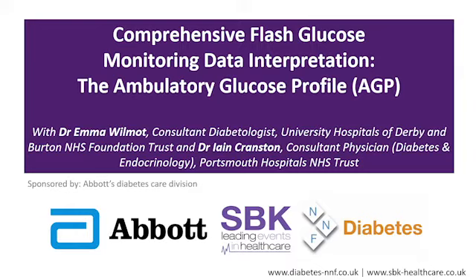through diary records of people, you cannot, when you're looking at numbers, in your head say what's usually happening. What tends to happen is your eye will get drawn to an outlier. Most of the time, your eye gets drawn to a dramatic outlier, and most of the time, the person that you're consulting with absolutely knows why that glucose level was a dramatic outlier. Oh, that was the day I forgot to take my insulin. And I, for one, don't think that's the highest value consultation.